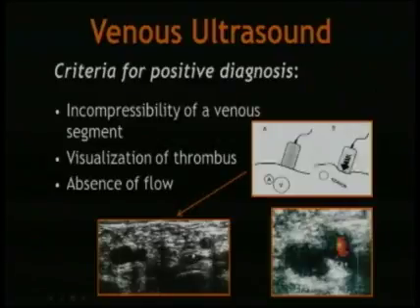As you can see, the vein disappears, however, the artery is visible. In this patient, this is diagnostic of a negative examination at that level. To the right, as we're pushing down, we see that the vessel walls do not touch. This is the common femoral vein and the common femoral artery. The vessel walls do not touch.